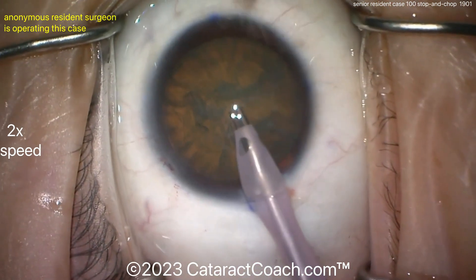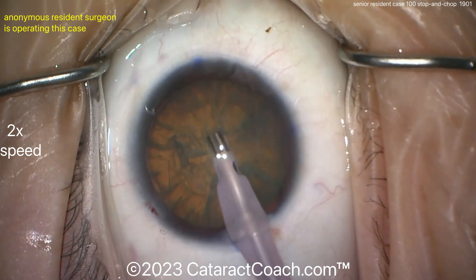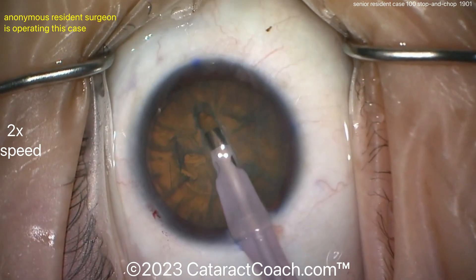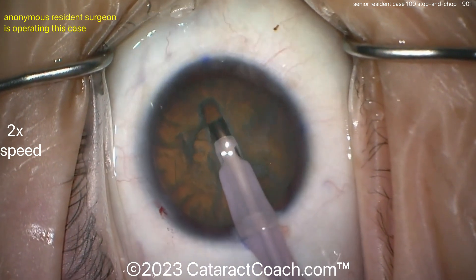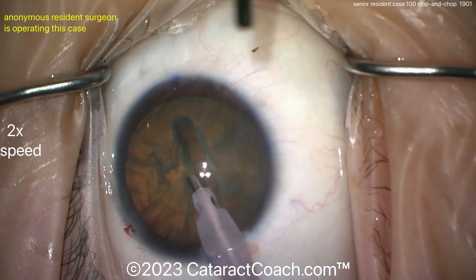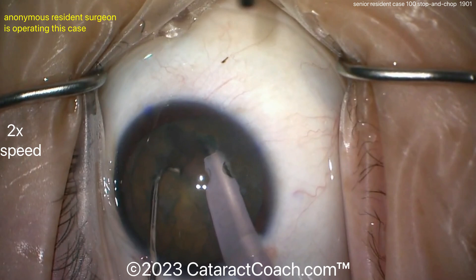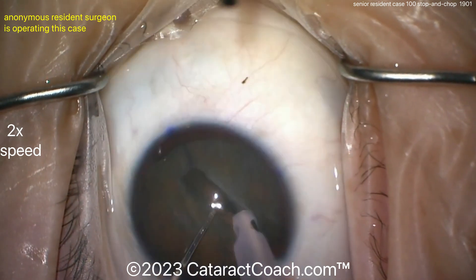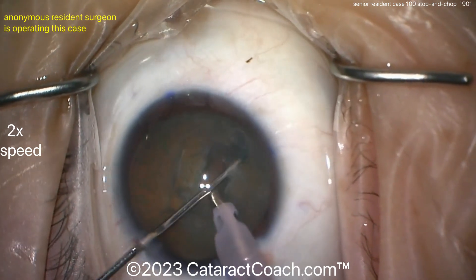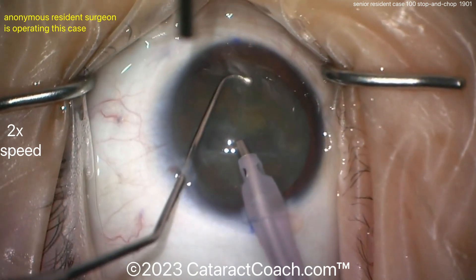The phaco probe going in — looks like a 2.75 or 2.8 with a purple sleeve. Let's see the technique: a groove down the middle, another groove. Look at the Purkinje images staying right there in the center — very nicely done. Another groove, another groove. May want to widen that up a little bit, but going for the crack. Put the instruments in there — a ball-tip chopper — there's a crack propagating all the way through, very efficiently done. Getting that nucleus to rotate.